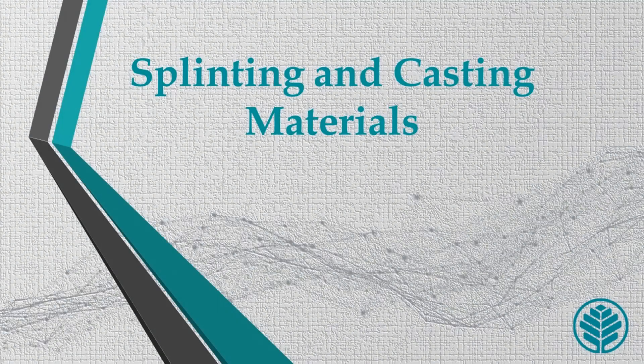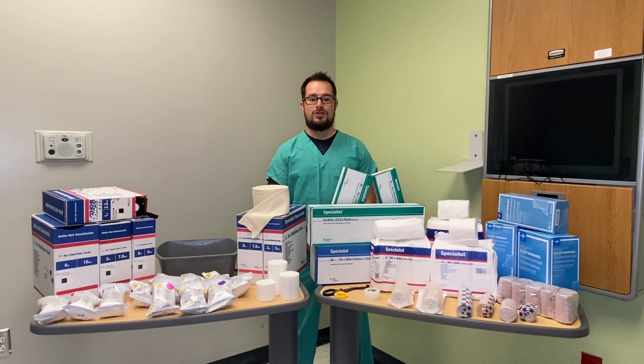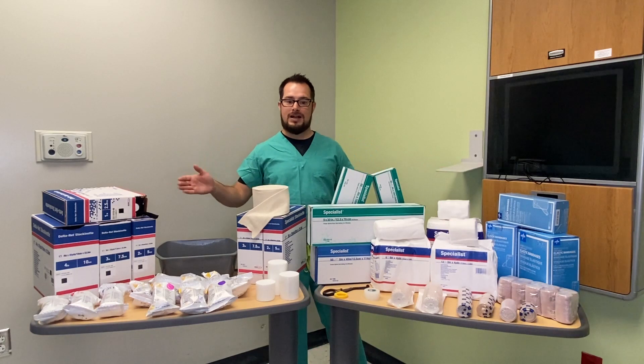No matter which material you may use, the general techniques are the same. I'd like to describe the different materials we use here at main campus. To my left we have plaster, and to my right we have fiberglass casts.